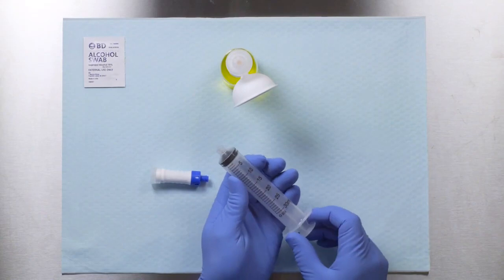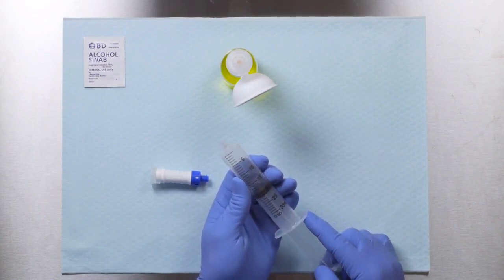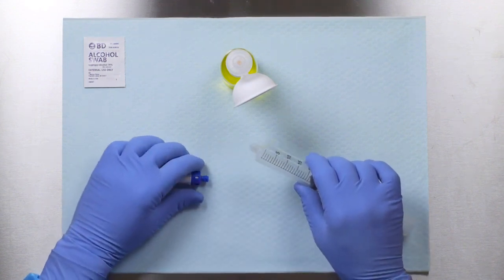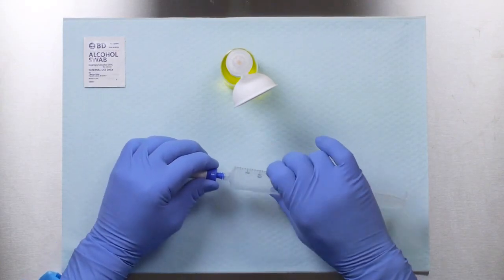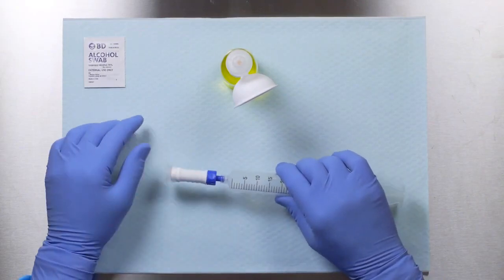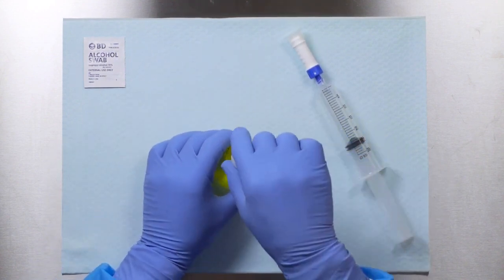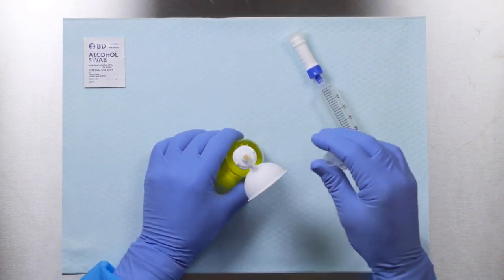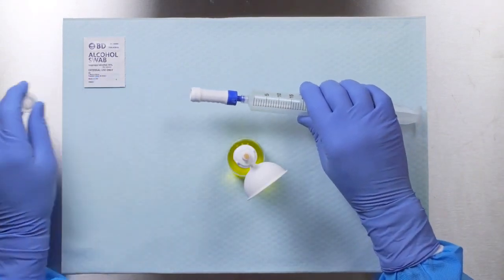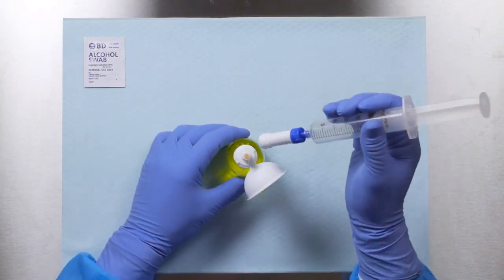Draw a volume of air equivalent to the dose into the syringe. Hold the blue hub on the injector and connect to the syringe. Ensure all luer lock connections are securely tightened. Remove the cap from the protector connection interface. Remove the injector protection cap.